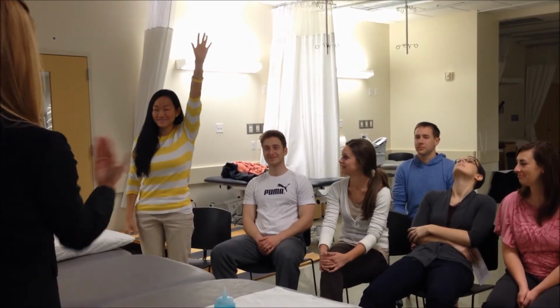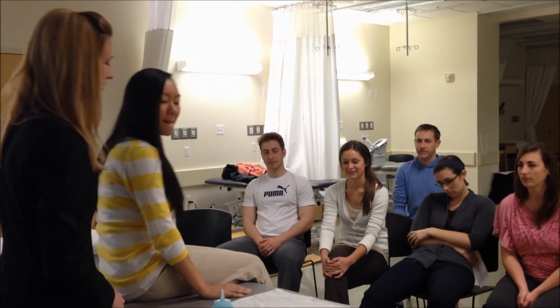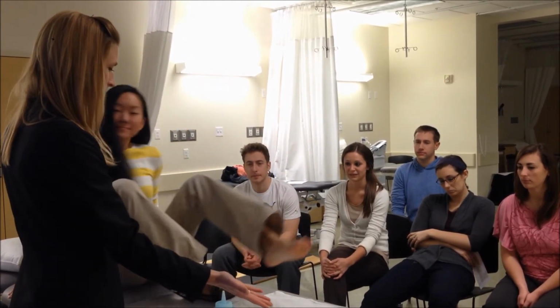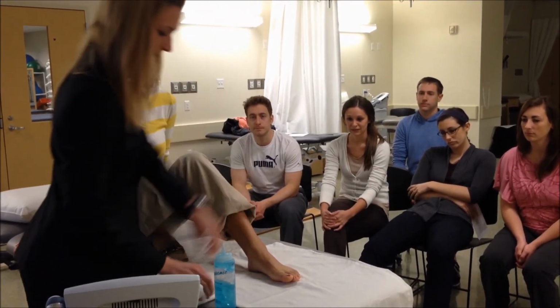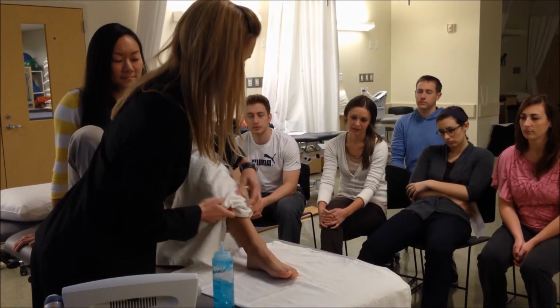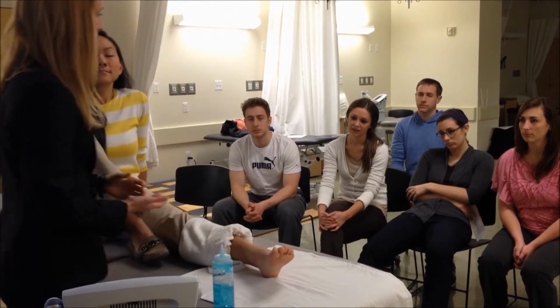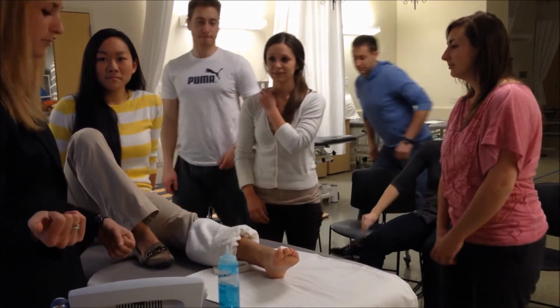All right, we're going to move into the demonstration portion. Can I get a volunteer, please? Me. All right, come please. Hop right up. We're going to do your anterior talofibular ligament, so please put it on the pillowcase here. We'll roll up your pants and put a towel around. All right, go ahead and relax that leg down. Okay, and come gather around because I'm going to show you guys how to use your new ultrasound machine.